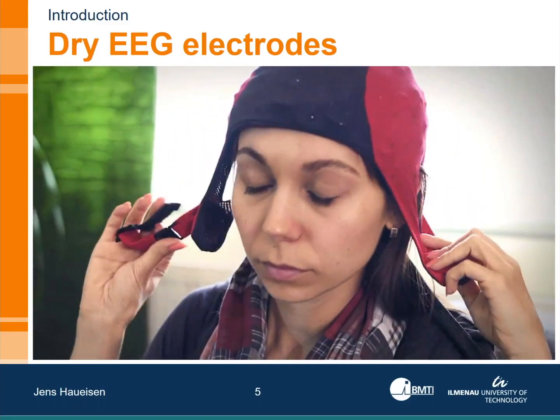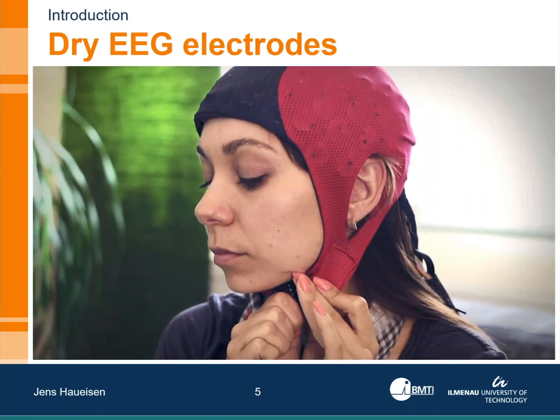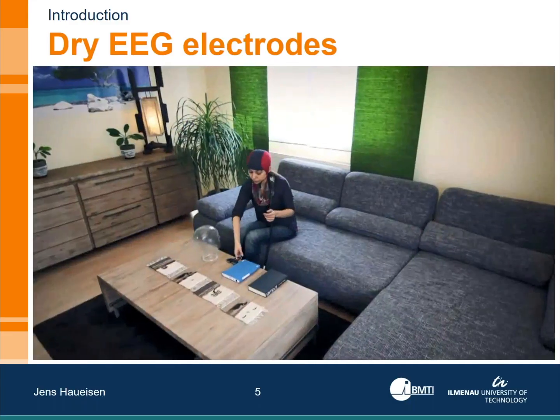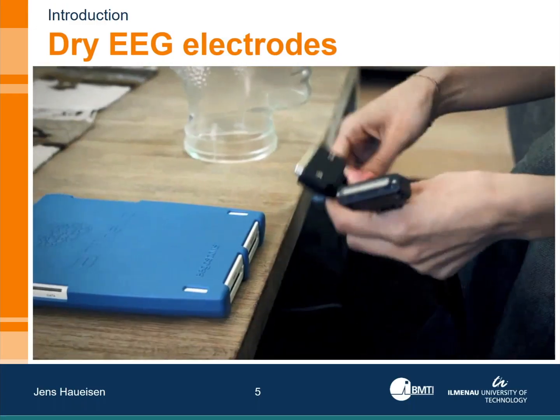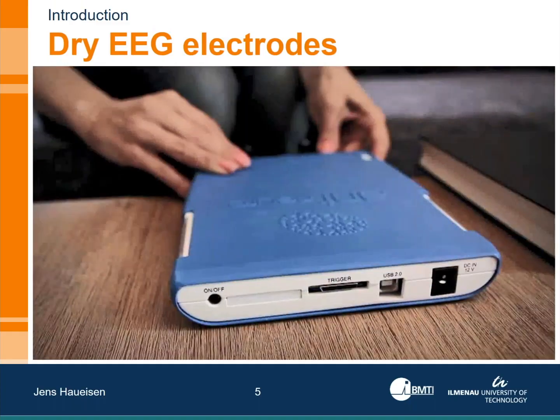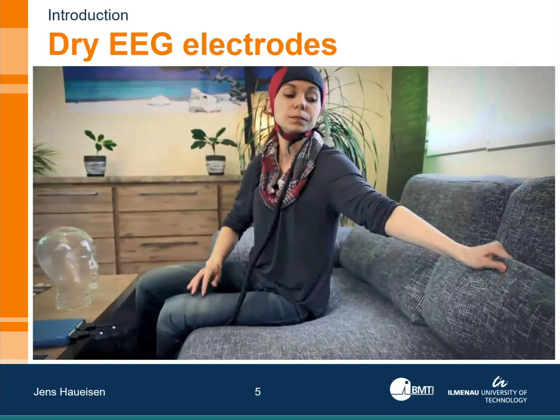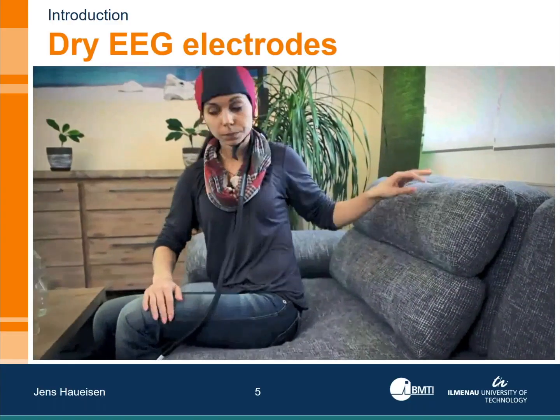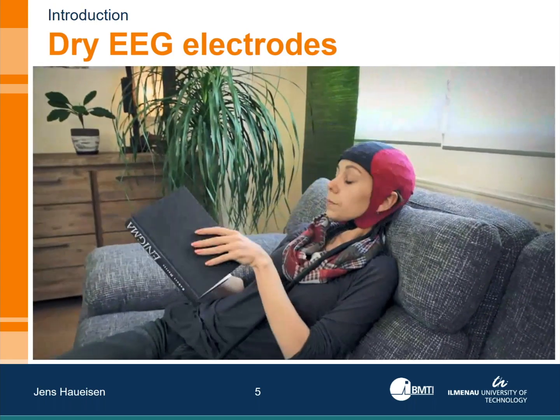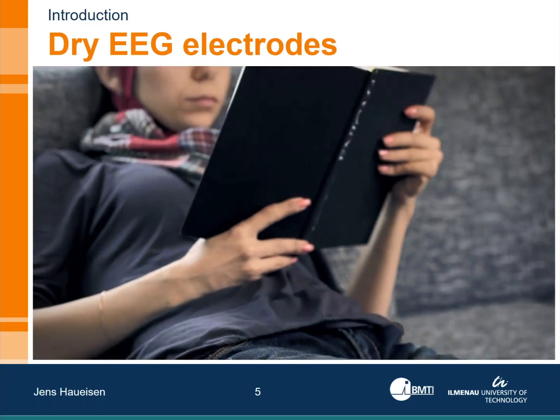So there is not really the need for trained personnel anymore. And the next thing to observe is that she is able to do recordings in a much faster way, with a much faster preparation compared to the wet electrode. So you just place the cup, move the cup a bit, and then start recording whatever you want to do in terms of your paradigm.